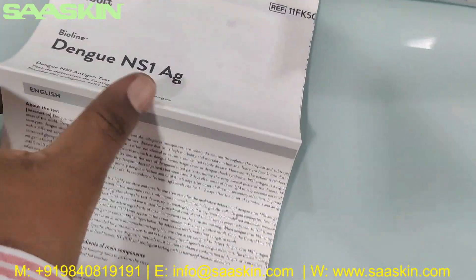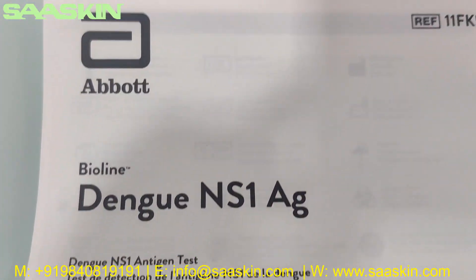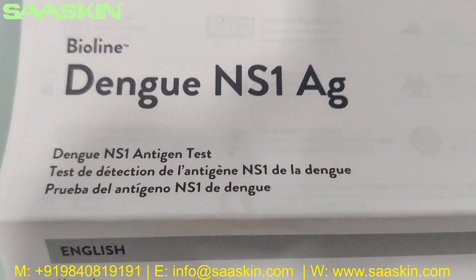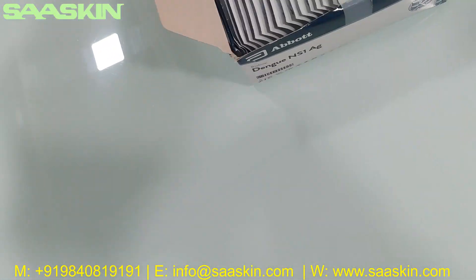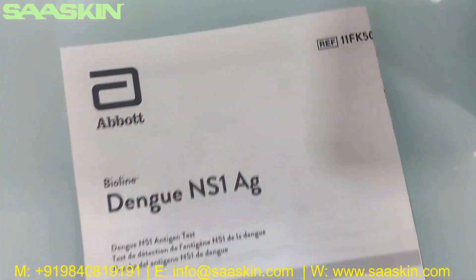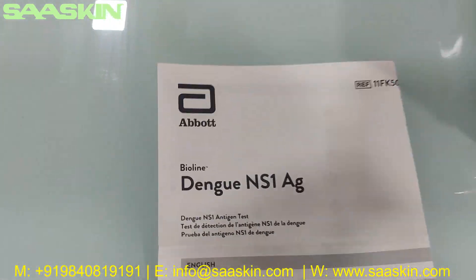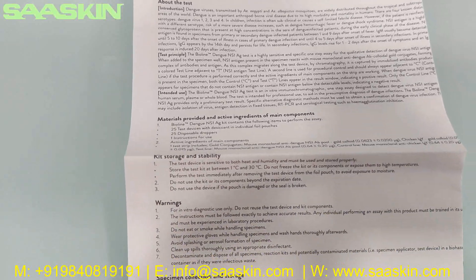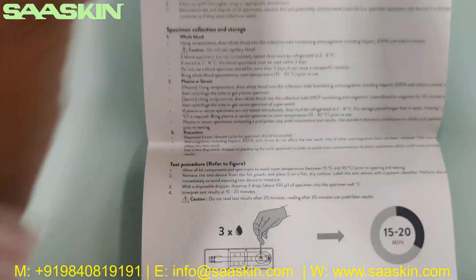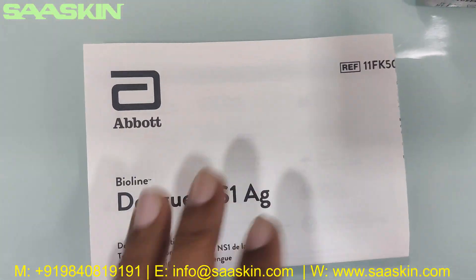Inside the box you can see there is an instruction for use manual. It says Abbott Bioline Dengue NS1 Ag kit — Dengue NS1 antigen test. This instruction for use brochure gives the complete instructions for preparing the samples, how to conduct your test procedures, and how to interpret the test results, so you have complete details to go through the test.